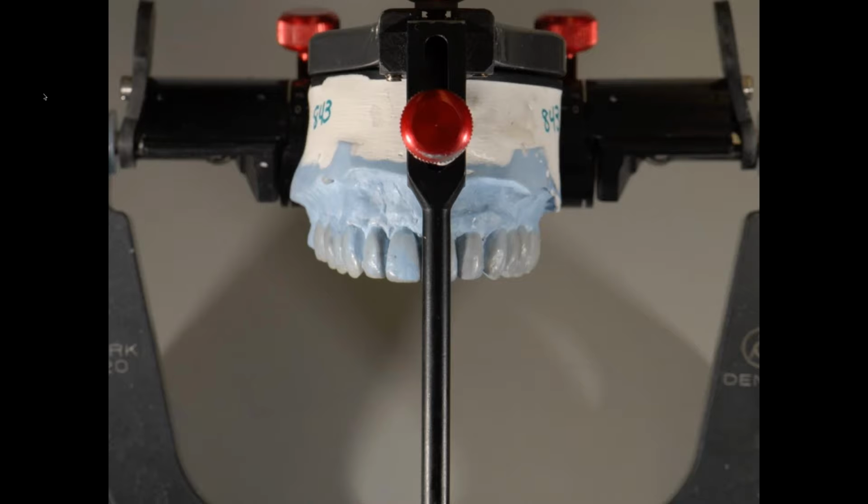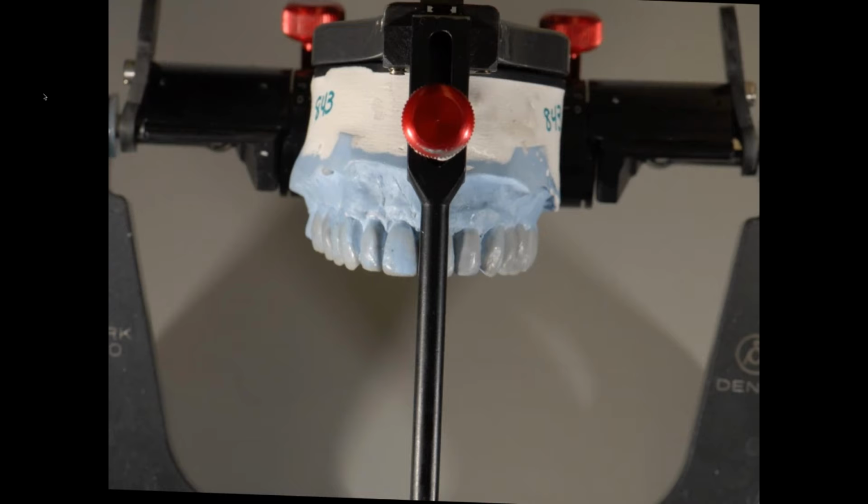So we had to go back and revamp everything because of the nature of the cant that we got by just a slightly mistaken face bow. Once we correct the face bow by that 3 or 4 degrees, it changes everything. And of course, you've got to be careful about the lip. I mean, her lip kind of goes every which way. Yes, we want to follow the curvature of the lip, but within reason when we're doing cases like this. So now we got a horizontal case that is right, but it took a redo to do it.